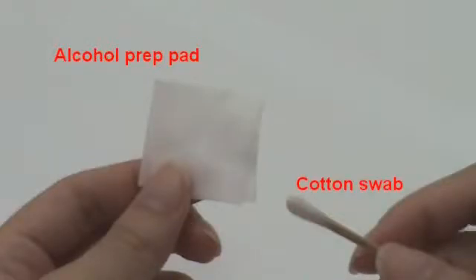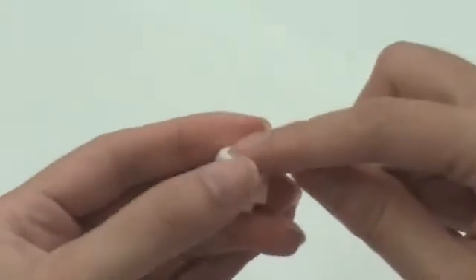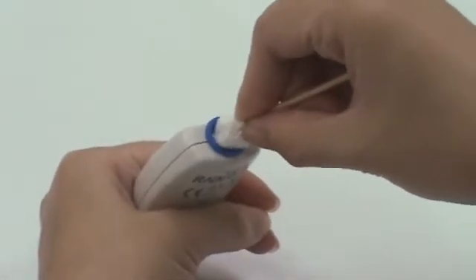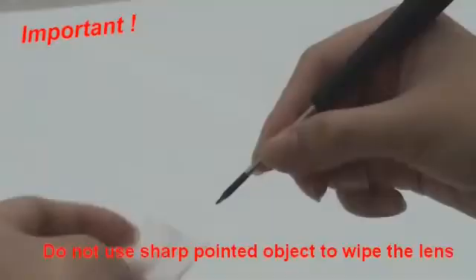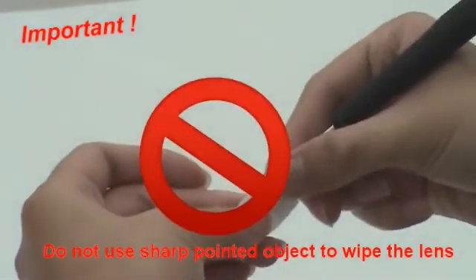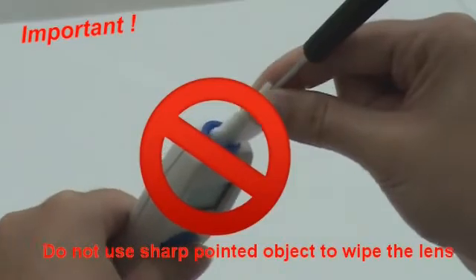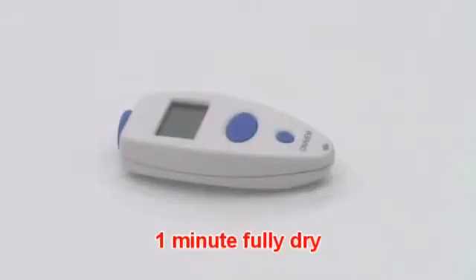If there is no 70% alcohol available, use an alcohol prep pad to soak the cotton swab. Do not use a sharp pointed object to wipe the lens. Allow the probe to fully dry for at least 1 minute.